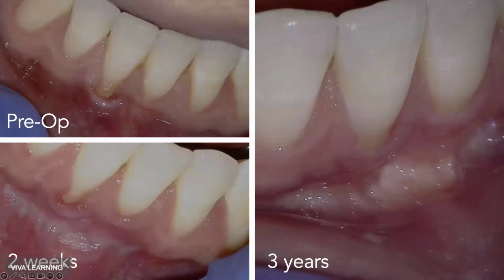Another question that came in: patient on blood thinners, will this laser help for soft tissue procedures? It's not in this presentation, but I have a Coumadin patient that I did a double crown lengthening for a bridge preparation on a couple broken teeth. And absolutely the answer is yes to that. Now, side note on that, we still consulted with his physician to make sure things were stable enough to do that, but I don't pull people off of blood thinners to do these procedures at all.